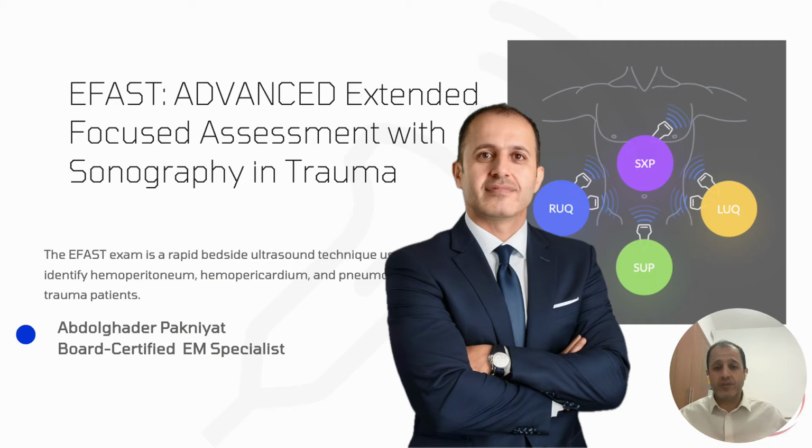Another one is the focus. So what is the area of interest? For example, if you want to check something at 10 centimeters, the focus should be set at 11-12 centimeters. So more focus will go on this area, and you can focus more on that area, with less artifact and better images with good resolution.